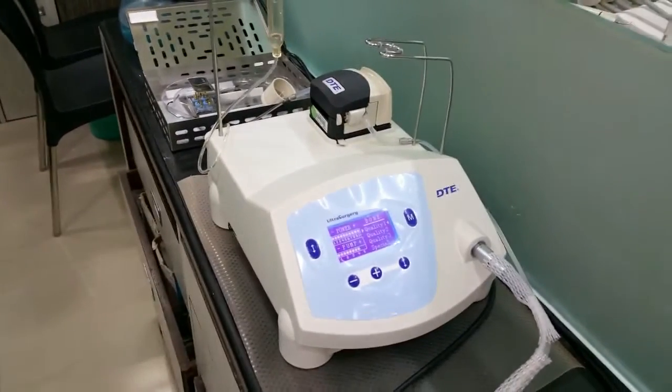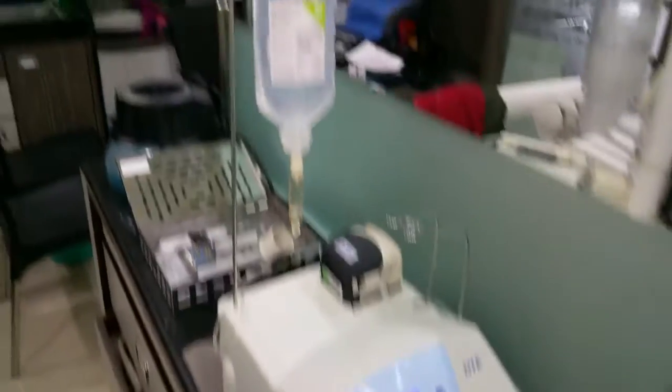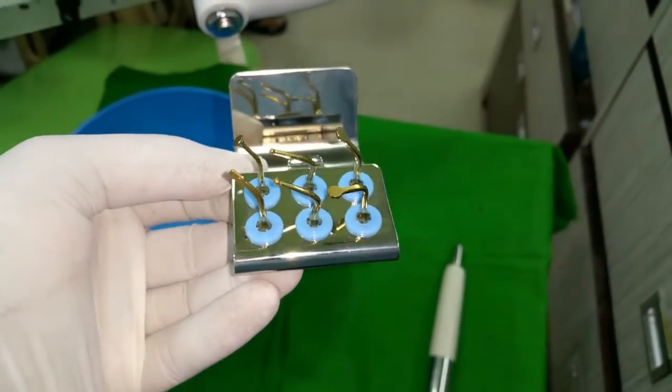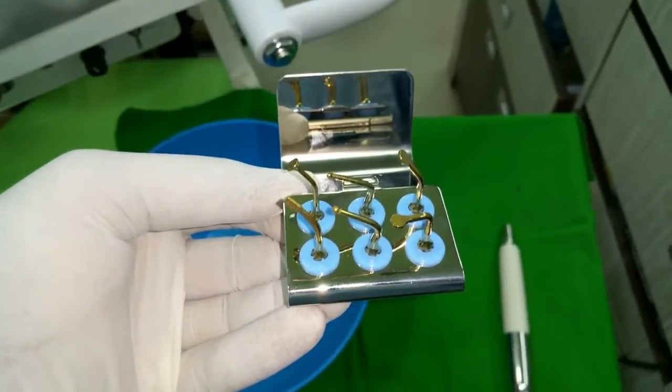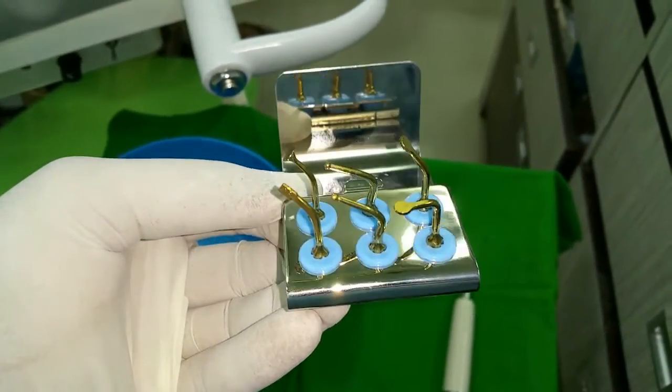So this is the Woodpecker Pizzo surgery unit. All attachments are attached with the unit. Here is a saline bottle through which irrigant will come out. And these are the various tips which we are going to use for this window preparation and membrane reflection. Similar tips are useful for the sinus lifting procedure.